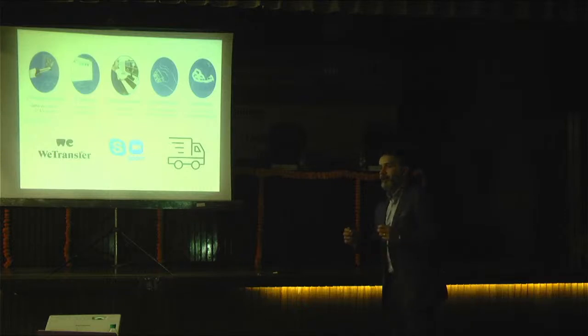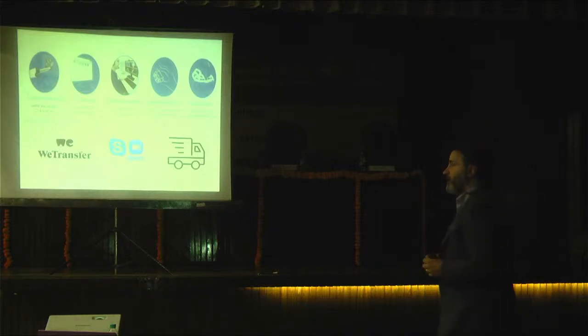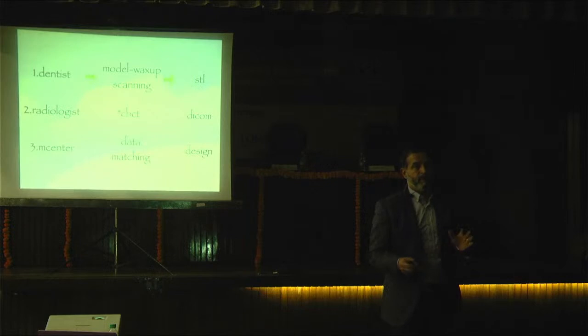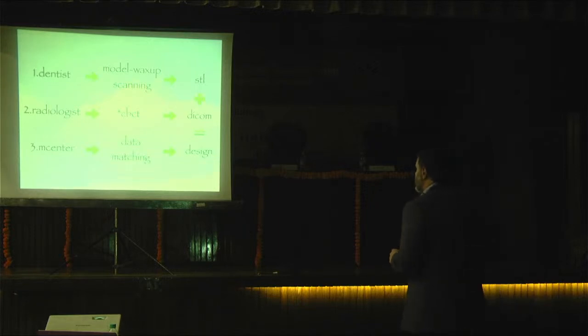And then we finalize our plan. Then it is very easy to click and manufacture the item, and then it'll be sent to your clinic. So, basically, maybe you can take this picture because it is very important for you.